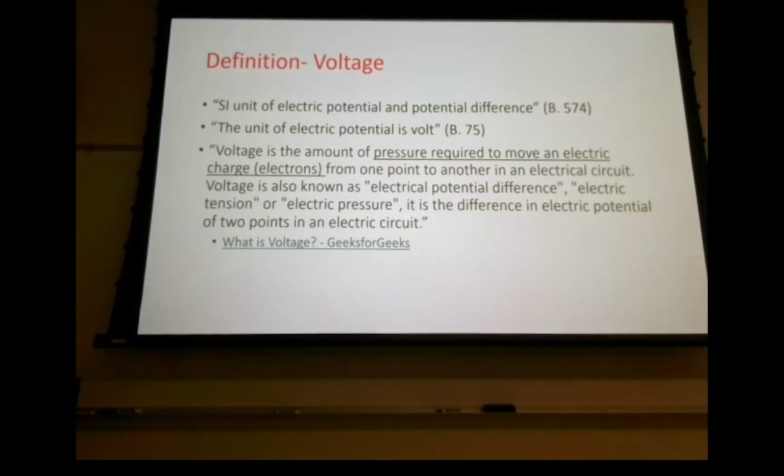So what moves is the electrons on the outside of it. So in order to move those electrons, you have to have some sort of motivation. And that motivation is adding more electrons, essentially, right? So you increase the electrostatic charge, and we talked about that last semester, and because all of our electrons are negative, you try to push them together, and what happens to them? They go apart, right? So like charges repel, so the more of those electric charges we cram together, the more motivation they have to move. And that motivation is measured in voltage, okay? So voltage, you can think of it as a pushing force, you can think of it as a pulling force. For our purposes, doesn't matter which way you look at it. It just is what makes the electrons move, okay?